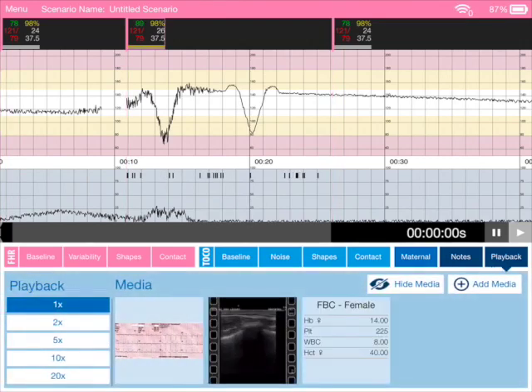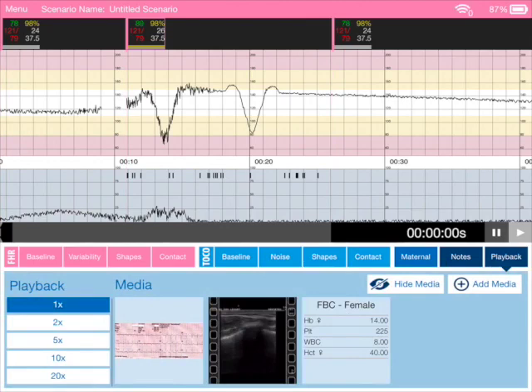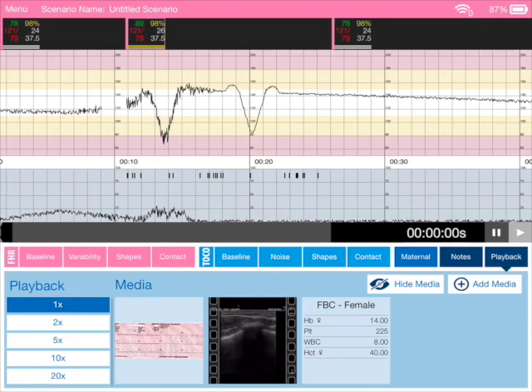So as you can see, a really simple, easy to use fetal heart rate and maternal tocograph simulator. When you press playback with another iPad with an app on it, it shows the trace in real time and it's just a beautiful, simple and easy way to simulate CTGs. Thanks.